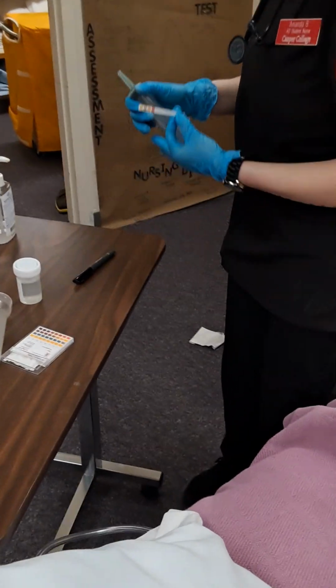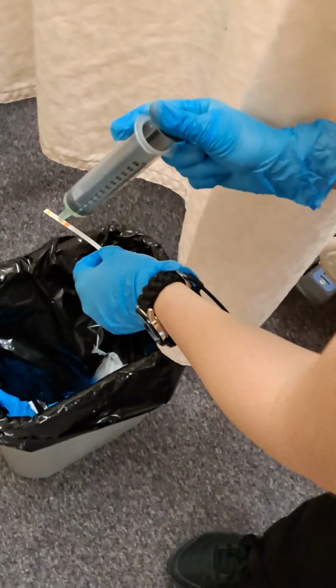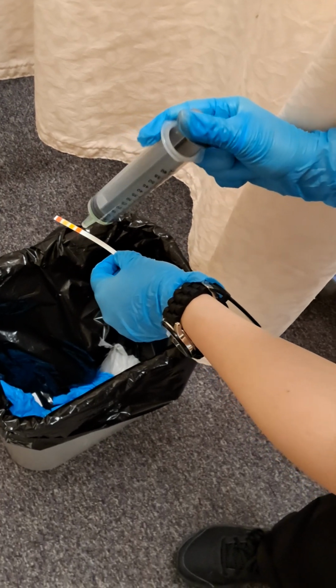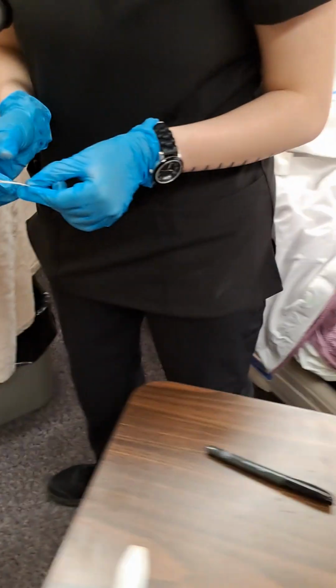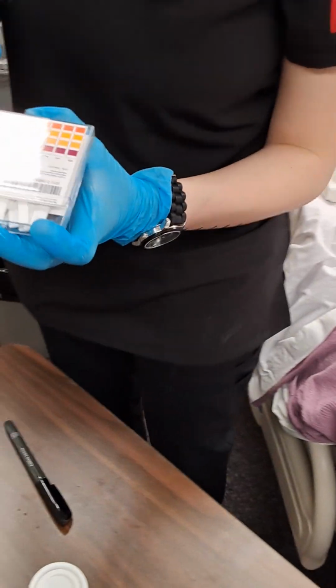Okay, I'm now going to test the pH. Okay, so I'm going to dispose of that, and my pH looks to be around a 4.